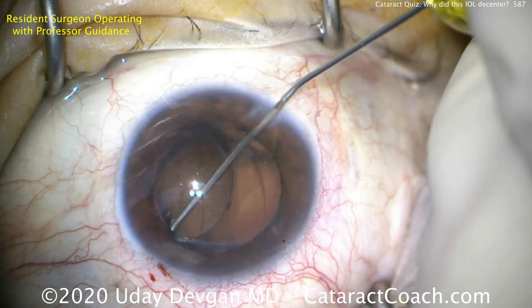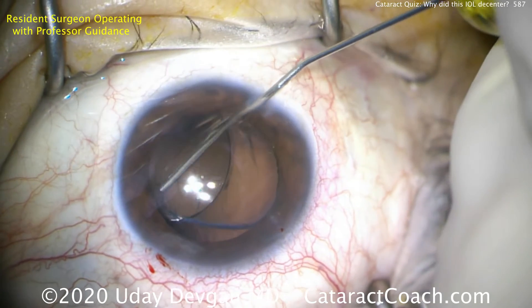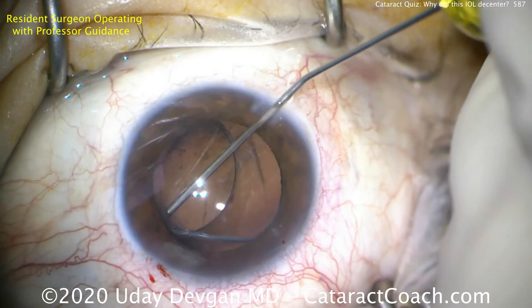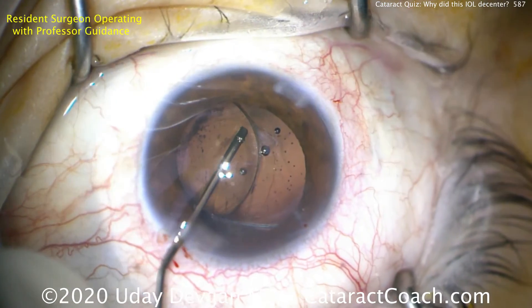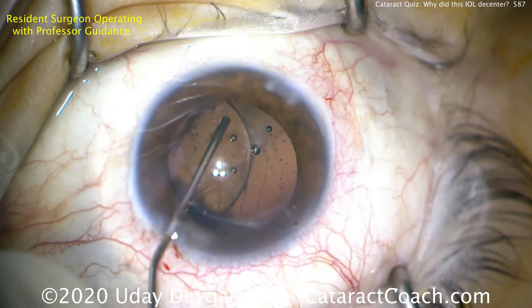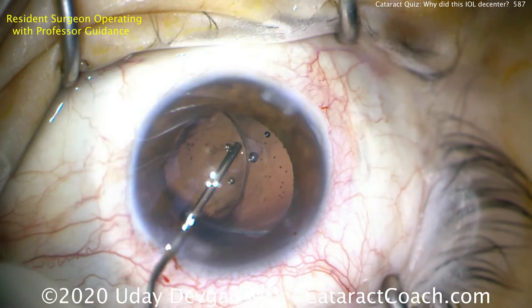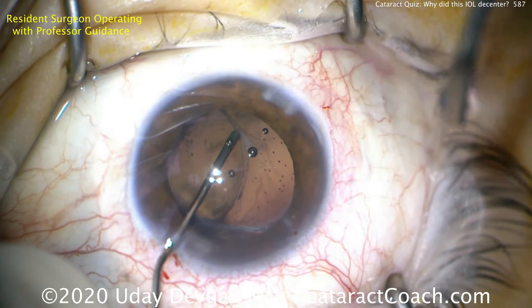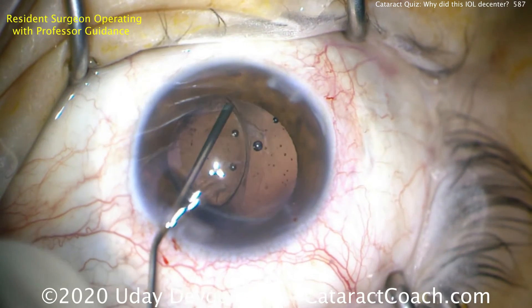Our first step here is to get underneath the capsular edge and inject our dispersive viscoelastic. We can't quite get it on that side, so we'll go around to the other side — getting under the capsular edge, and once we have that, injecting the dispersive viscoelastic to dissect open the capsular bag. That visco dissection is nice and gentle and very effective.